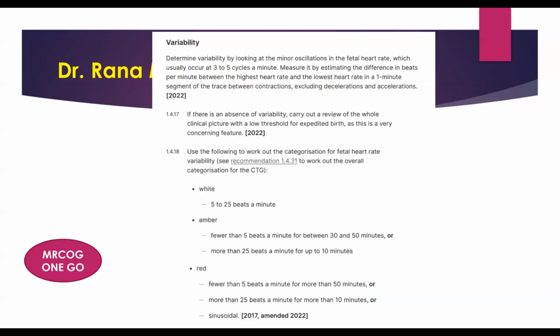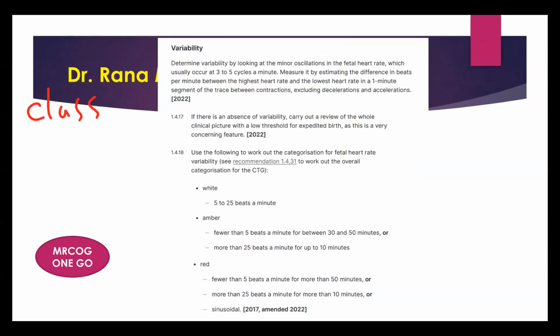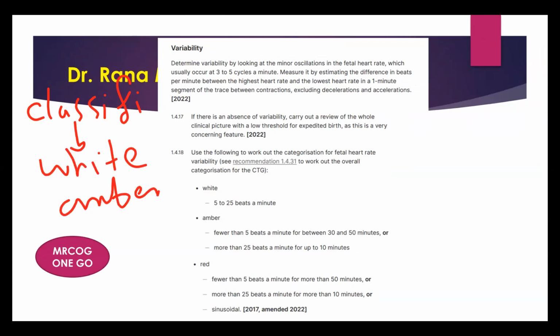Anyone? Okay, so as we mentioned, the features, we will give the classification: white, amber, red.